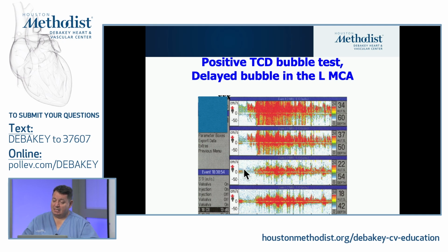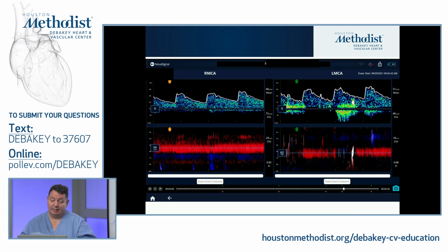So this is again, this bubble delayed in the left MCA is because you have a left ICA occlusion and the bubble crossing. So delay, that's again another suspicious, good pitfall for my TCD. And here's another pitfall. Again, you don't see anything on one side. On the left side, I see the bubbles, one single embolus. So that is one bubble. So it's a positive study with the ICA reflux.